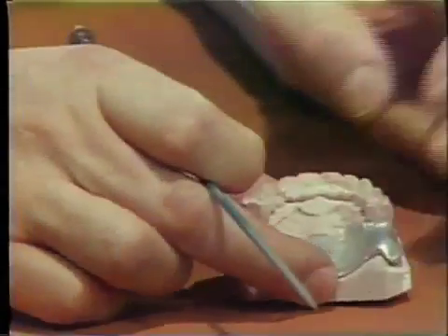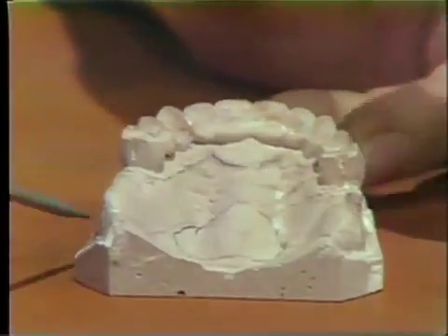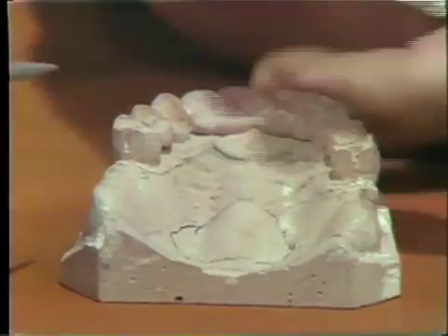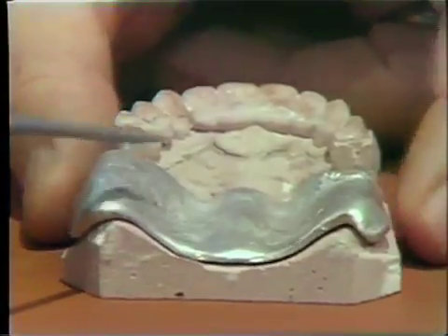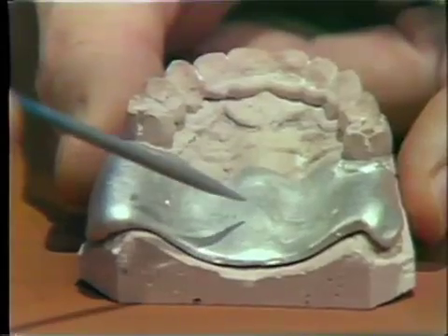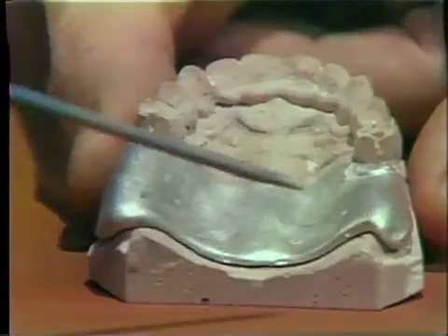The fabrication of the tray for the maxillary is quite similar. Pink baseplate wax is adapted over the area where you want the tray — one thickness to act as a relief, and then two thicknesses for the tray itself. This is invested in the same way. Should you have a full arch impression or something larger, it is permissible to use a forme tray, because in that bulk you get good strength.